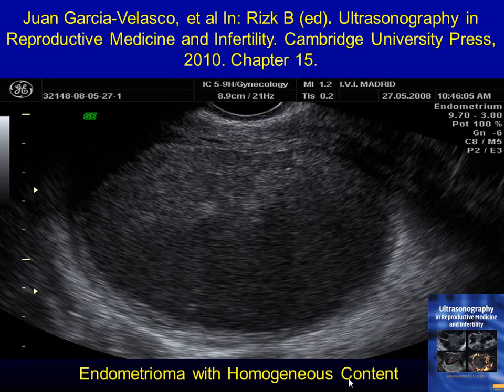What about the ovary? The ovary quickly has lesions. Fortunately for us, they are easily discernible. And from our residents' point of view, really it's ideal if you're going to do those in your office that you just keep in your mind there are only 3 or 4 common things. Forget about the rare stuff, the weird stuff that we talked about.